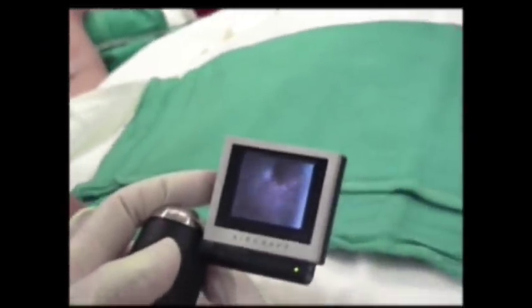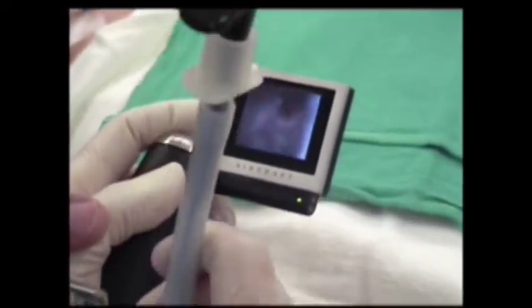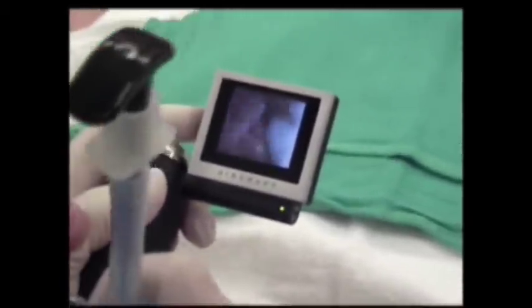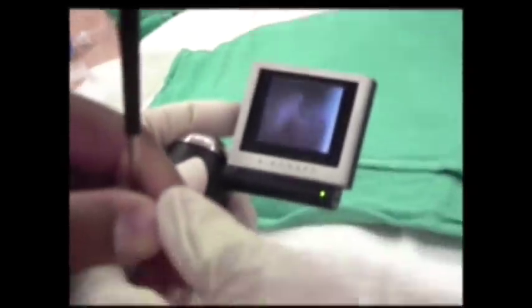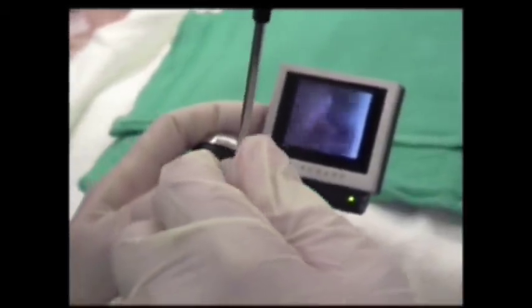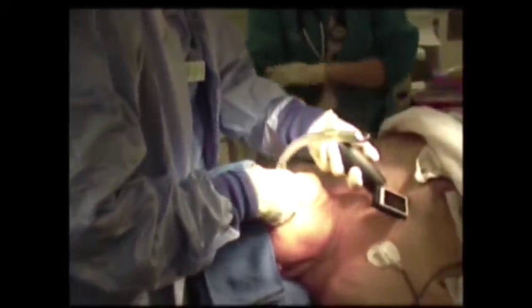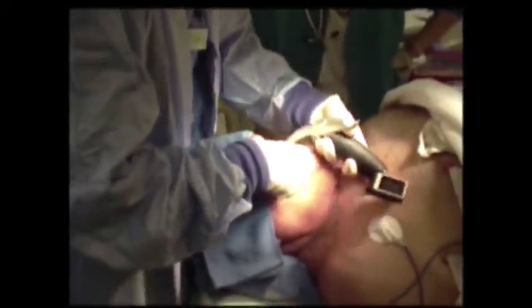In the operating room footage: come back with it to blade just a little bit — okay, there you go. Sliding this into position and flipping it on. You just don't want to go too deep.